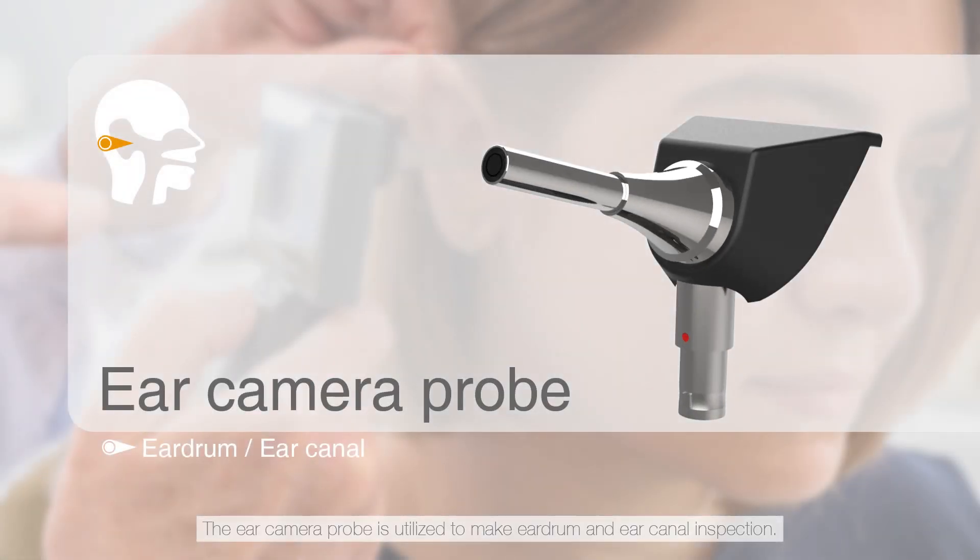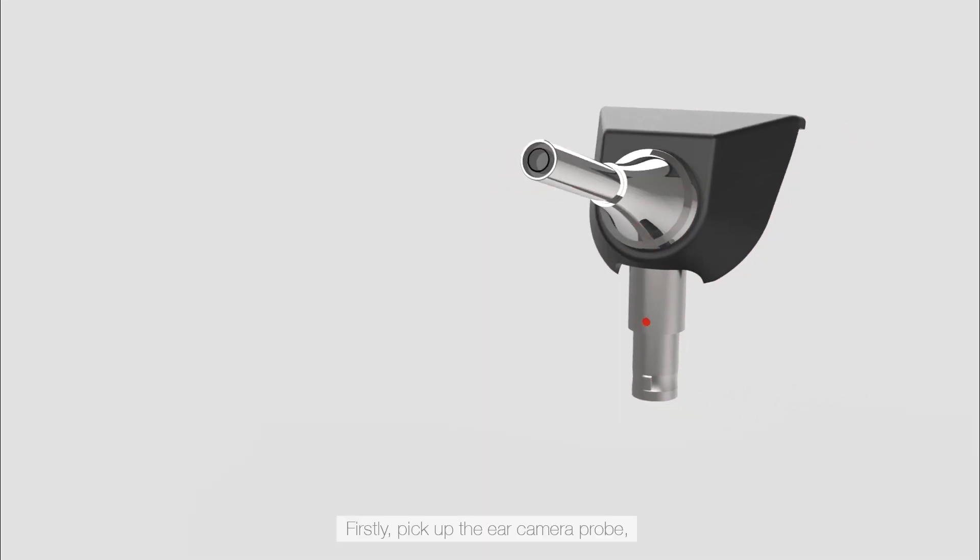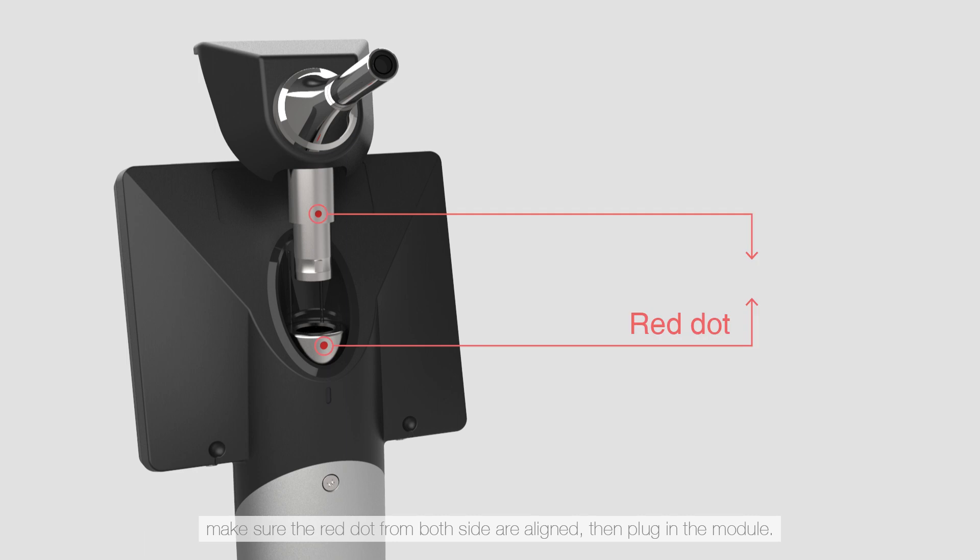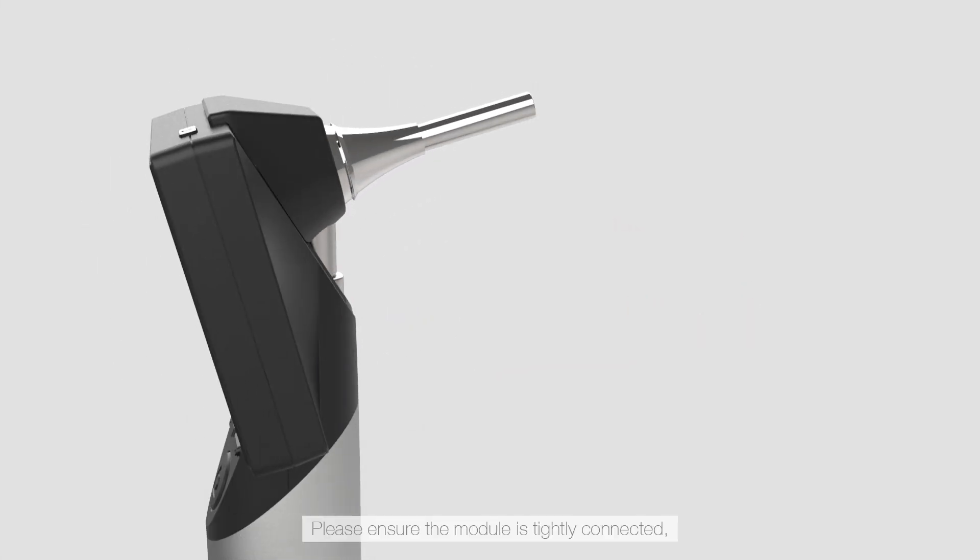The ear camera probe is utilized to make eardrum and ear canal inspection. Firstly, pick up the ear camera probe, make sure the red dot from both sides are aligned, then plug in the module. Please ensure the module is tightly connected, leave no gap between the module and main device.